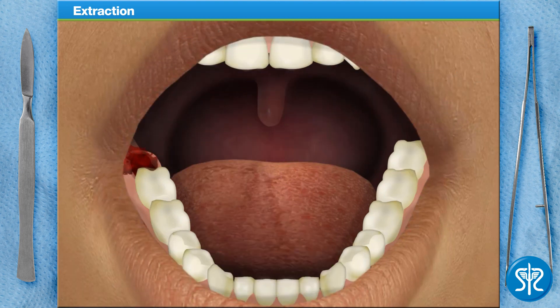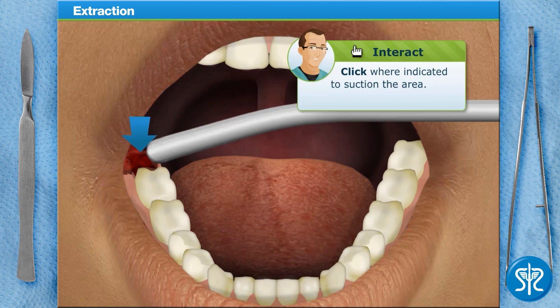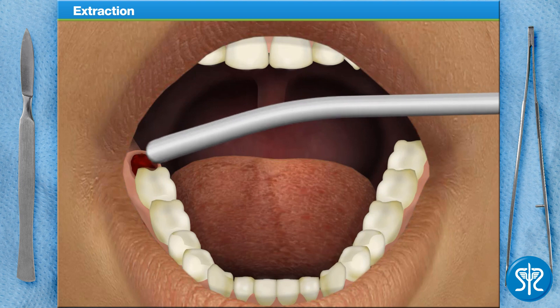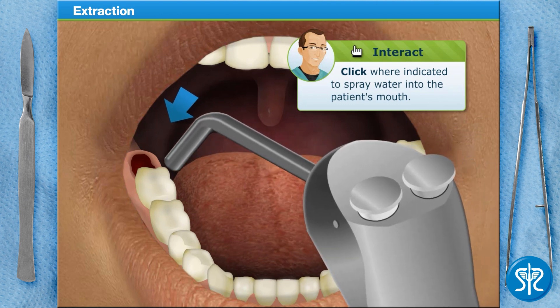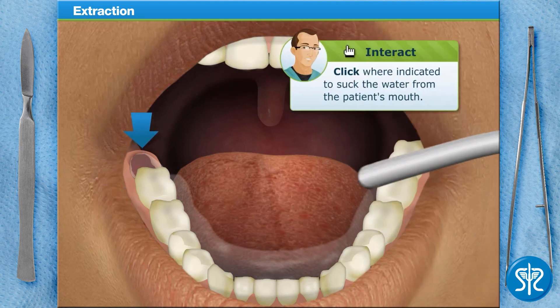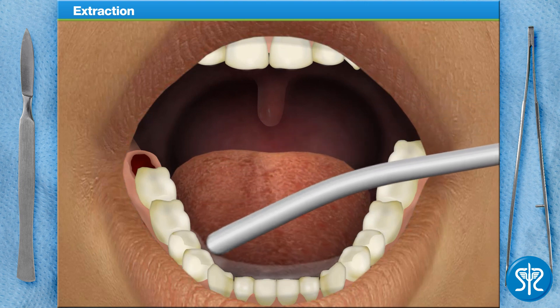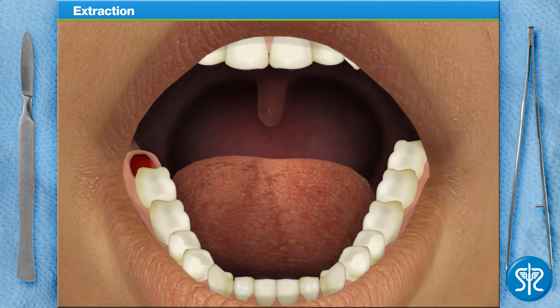Now clean the area using a surgical suction. This will allow us to check the area for any bony matter or tooth structure that may be left in the socket. Our patient needs to slowly bite down on some gauze for a few minutes, to allow the socket to properly form a clot.